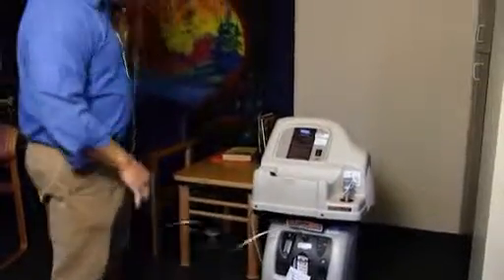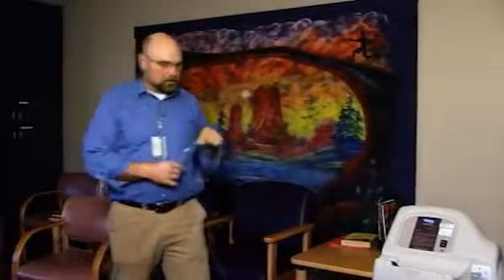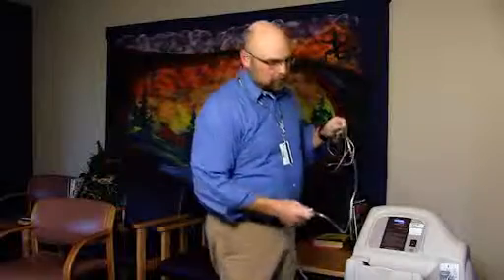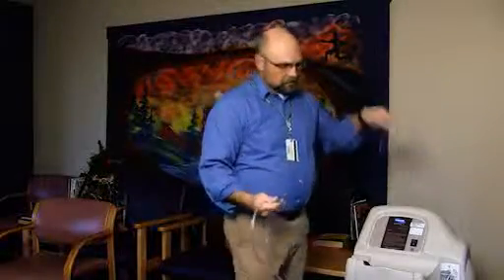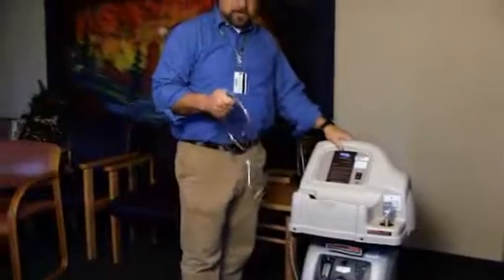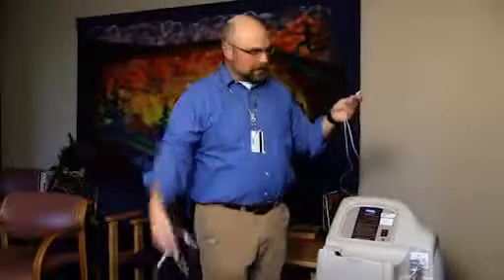But let's say the tubing. Right now, today we just have a 7-foot hose, but a lot of people will do a 25 or a 50-foot hose. The rule is on the 50-foot or the long tubing, or anything that's not touching your face, you want to do that monthly and simply disconnect from the cannula and disconnect from the end of the hose or the concentrator and throw that away or recycle it.